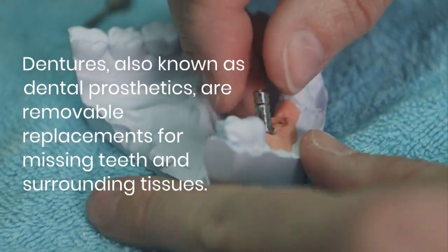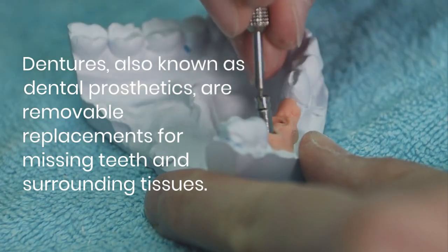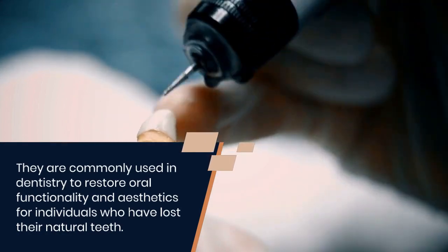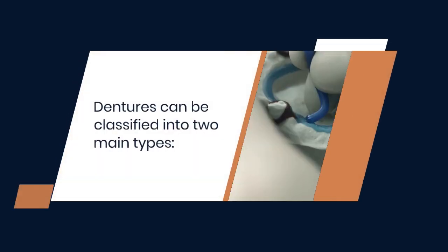Dentures, also known as dental prosthetics, are removable replacements for missing teeth and surrounding tissues. They are commonly used in dentistry to restore oral functionality and aesthetics for individuals who have lost their natural teeth. Dentures can be classified into two main types.